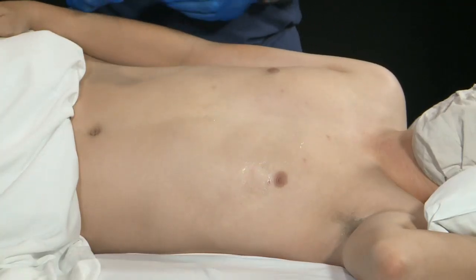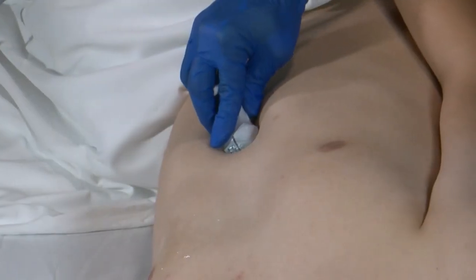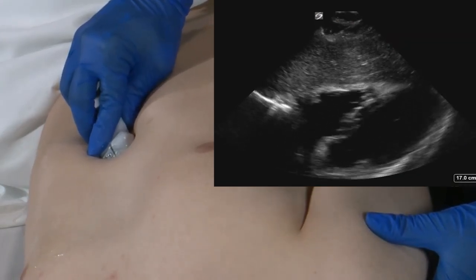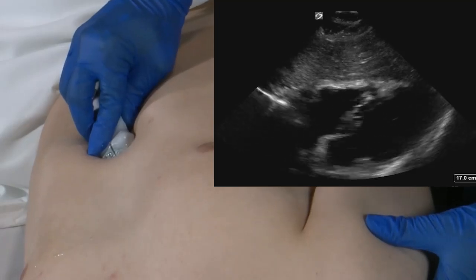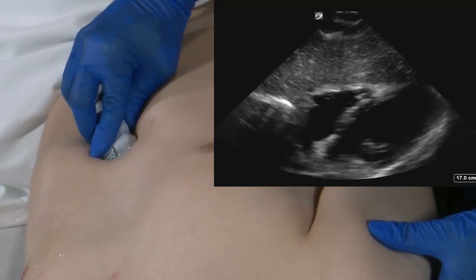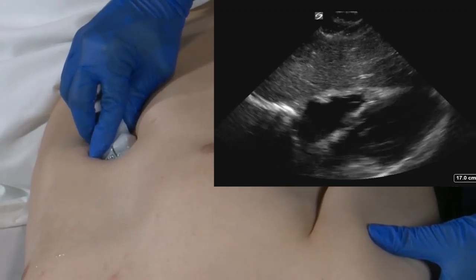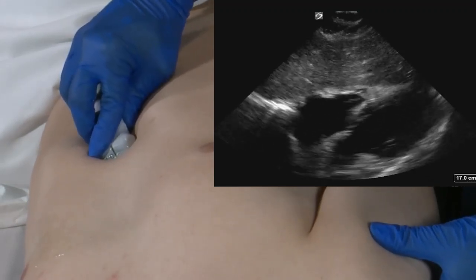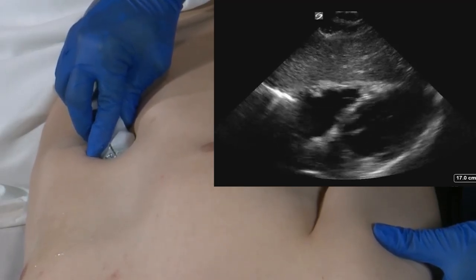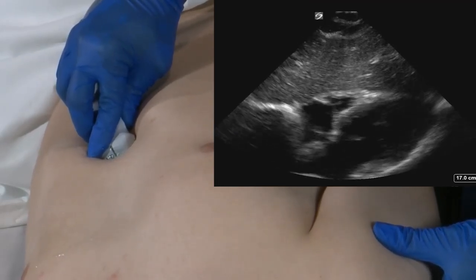Next, we will image our subcostal four-chamber view. To do this, we're going to put the transducer immediately underneath the xiphoid process. We'll hold the probe almost flat against the abdominal wall, and the marker dot is going to be directed towards the patient's right flank. Here we're using the liver as our window to see into the heart. We will identify the right ventricle, the right atrium, the left ventricle, and the left atrium. We'll pay particular attention to the pericardial sac, looking for any pericardial fluid that may be visible or detectable in this orientation.